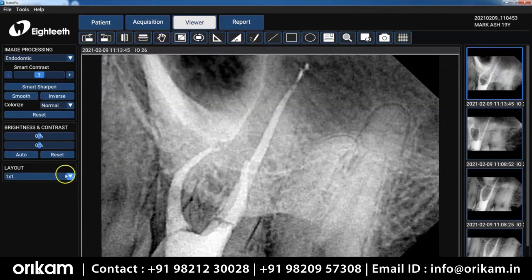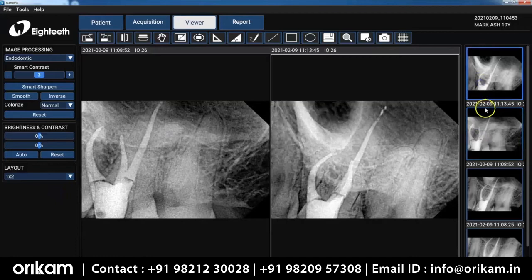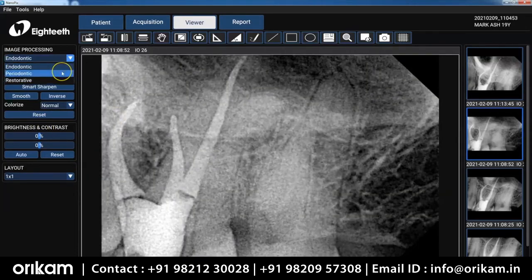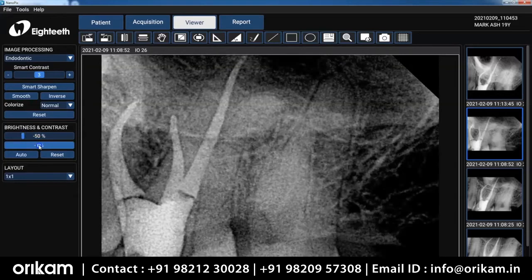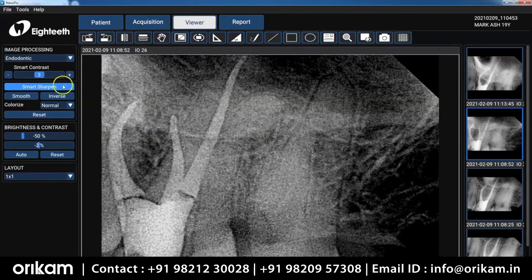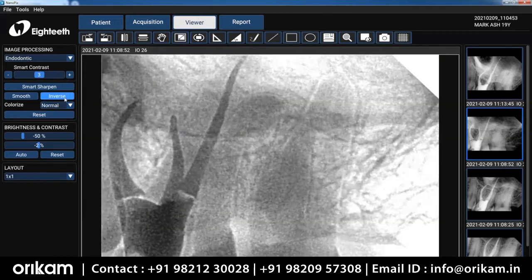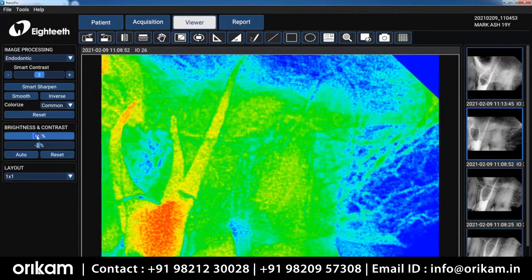Now we've acquired our image — let's use the viewer to manipulate it and take a look at the image more closely. I've got it set for two by one, but you can totally change it to however many images you want — we'll set it to one by one. Let's take a look at the different filters: Endo, Perio, and Restorative. I'm going to set that back to Endo. I haven't really gotten used to using the smart contrast, but the smart sharpen I love — as you press it, it increases the sharpness of the image. The colorized options are available there as well, and using the brightness and contrast allows you to manipulate the different densities in the image.